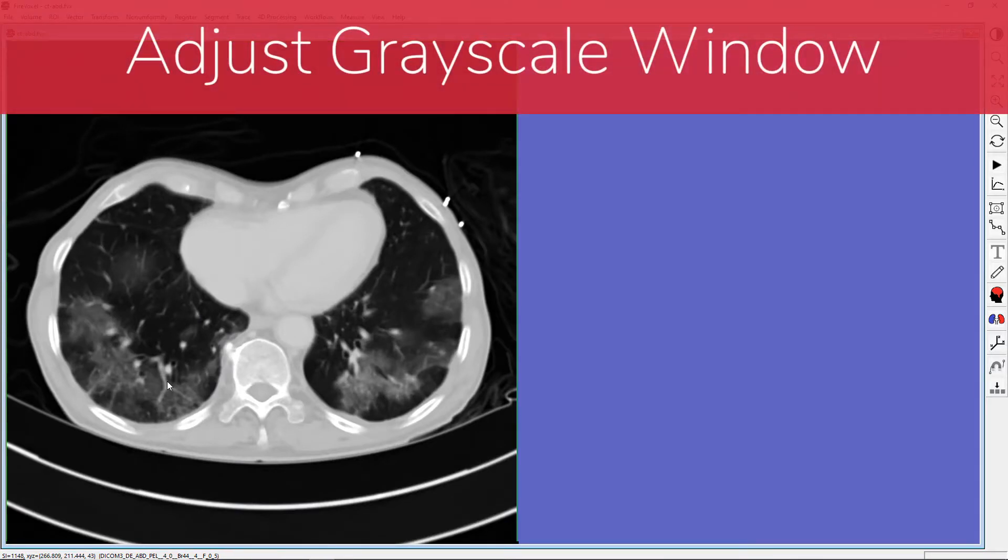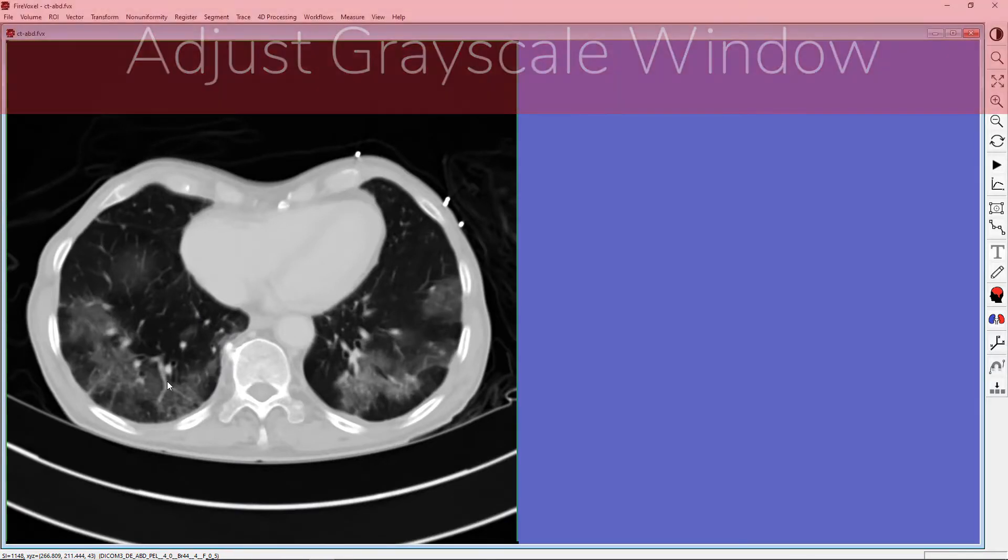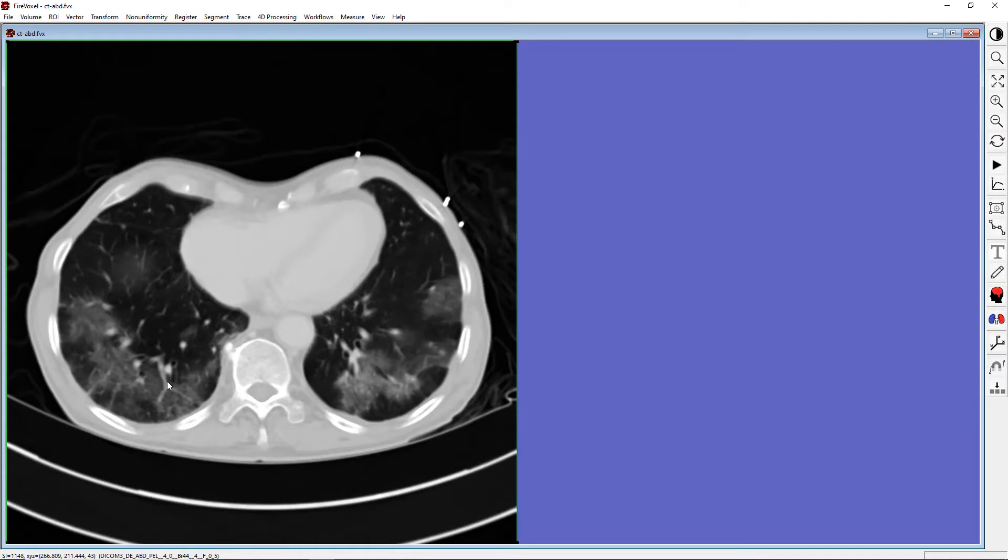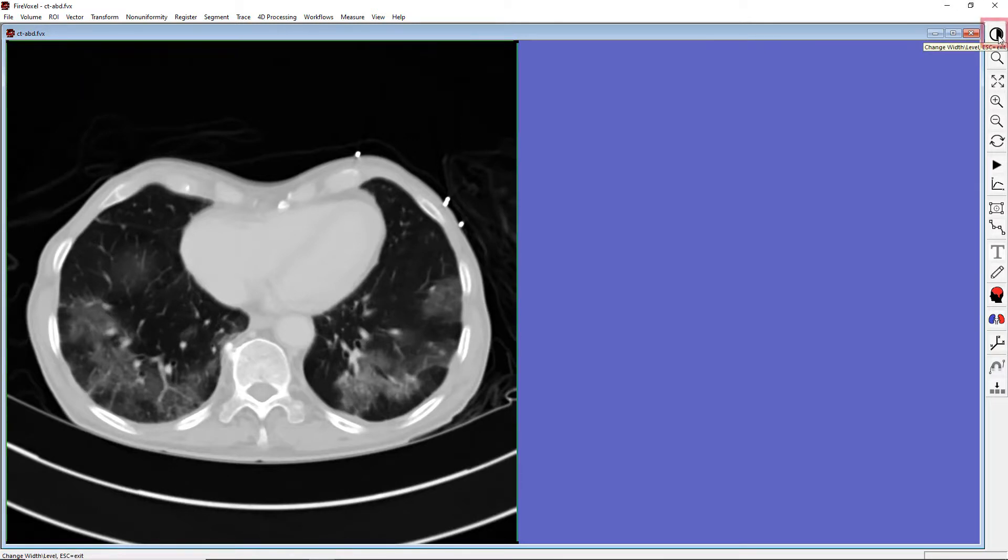Next, let's adjust the grayscale window for optimal viewing of different tissues. We can do this by using the Change Width and Level tool on the main toolbar. Click the icon with a black and white circle, and the cursor also becomes a circle.